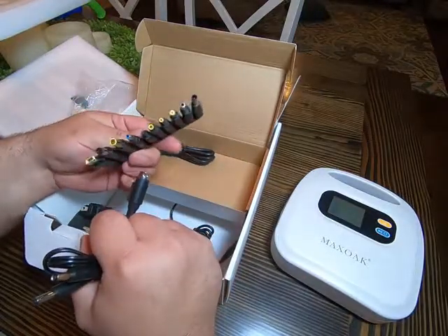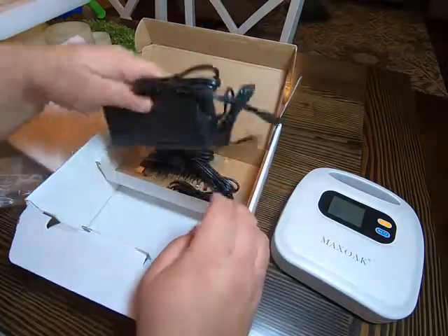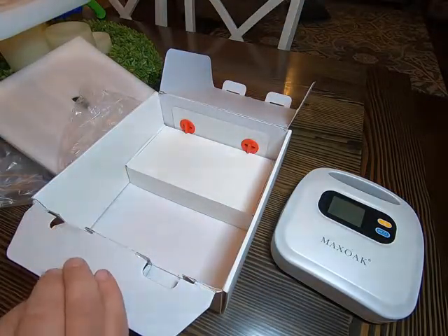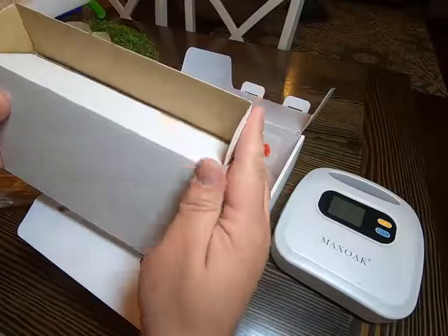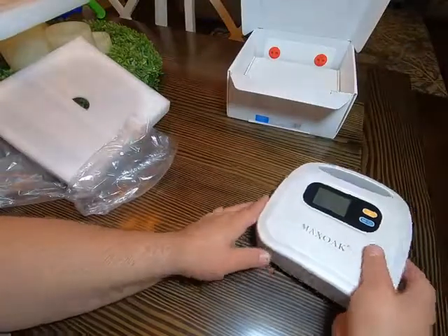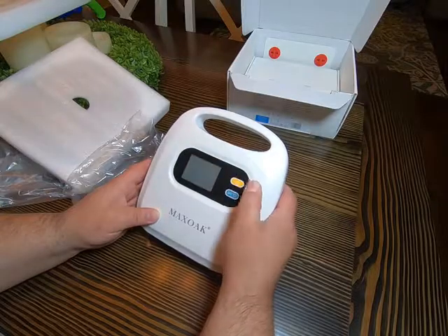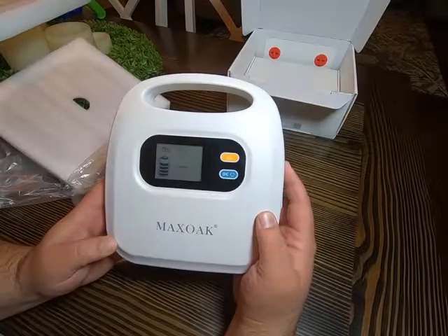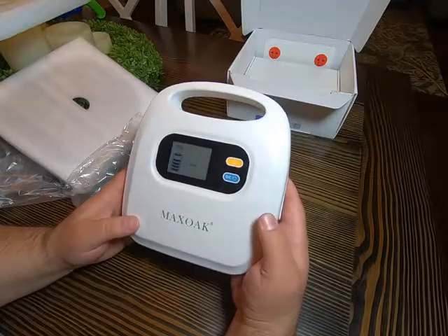These appear to be all the various power adapters to power pretty much everything you might want to — that's a pretty good assortment. I don't imagine there's much you couldn't power with this thing. The other box appears to be empty, so I'll push it aside and power this on to see what it says.